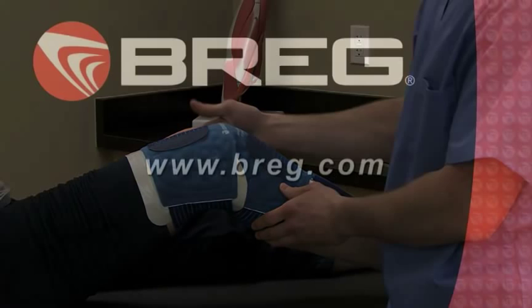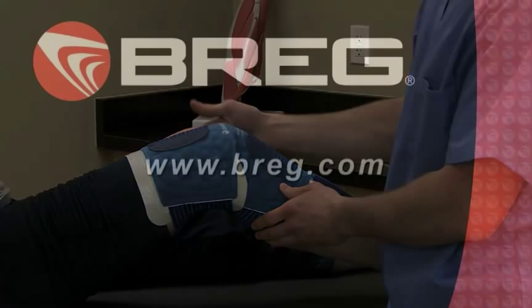For information on how to properly connect the PolarCare unit or for troubleshooting tips, see the product in-service video. Thank you for choosing PolarCare.